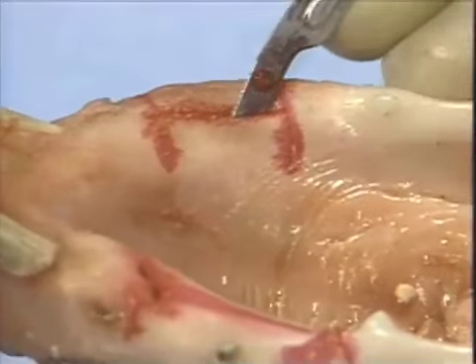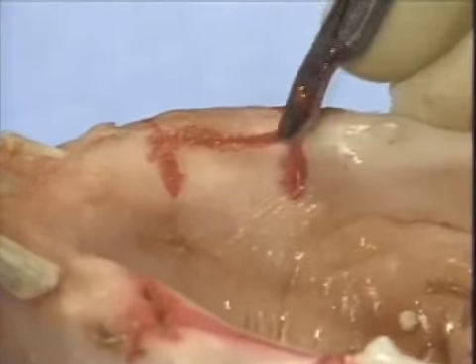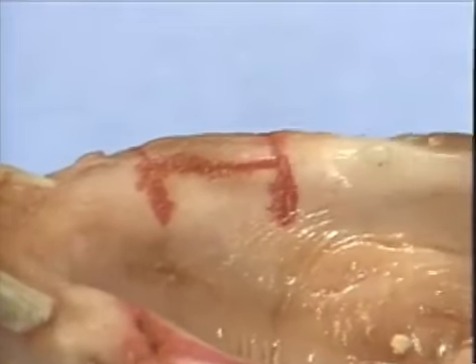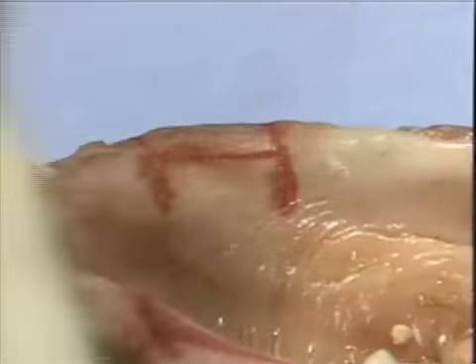Once the initial incision is placed, the angle of the blade can be changed to undermine or thin the lingual flap. In this case, we would like to produce a lingual flap which measures 1.5 to 2 millimeters in thickness.